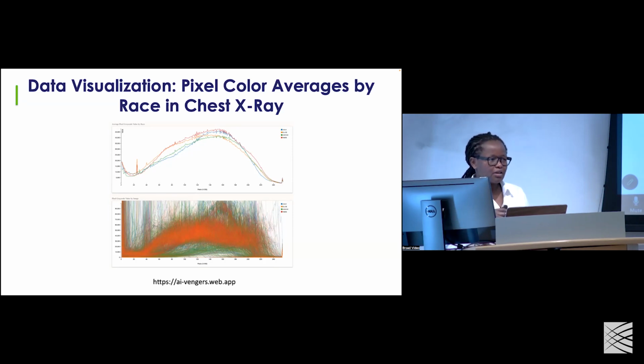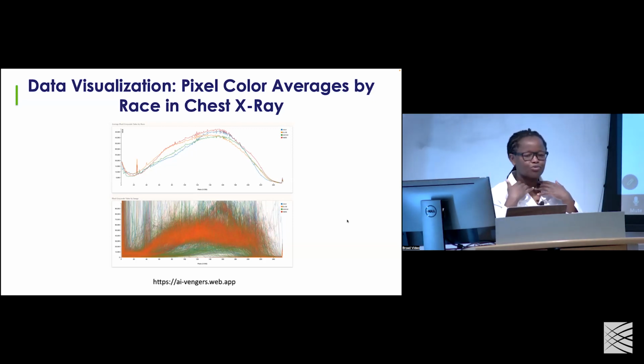We never really explored this further, but what happens at Emory is that every time you get a chest X-ray, someone else had come up with another visualization, especially for ICU radiographs, because you can have so many things on the patient. And remember, this is just one 2D view of the patient, and you're not sure, well, is this tube outside the patient or inside the patient? And so you get sort of visible light imaging. So every time I get a chest X-ray, it also takes a picture of my face, right? It's not necessarily supposed to be for you to identify the patient by the face, but it's supposed to be saying, okay, maybe this patient has something, and their ET tube is on the patient, so that as a radiologist, you can quickly look and say, oh, okay, I know what that is, and it helps your interpretation.